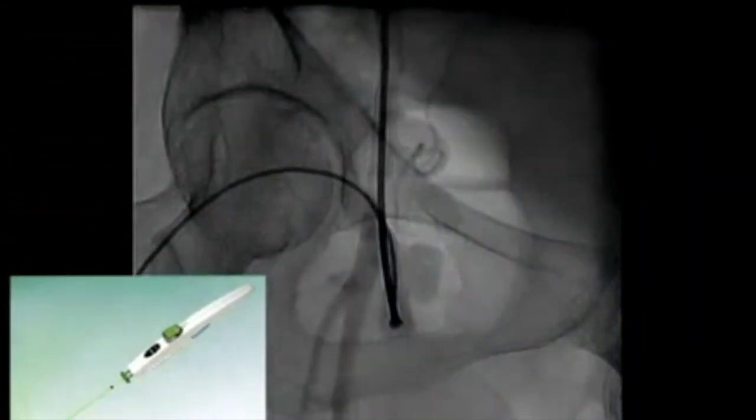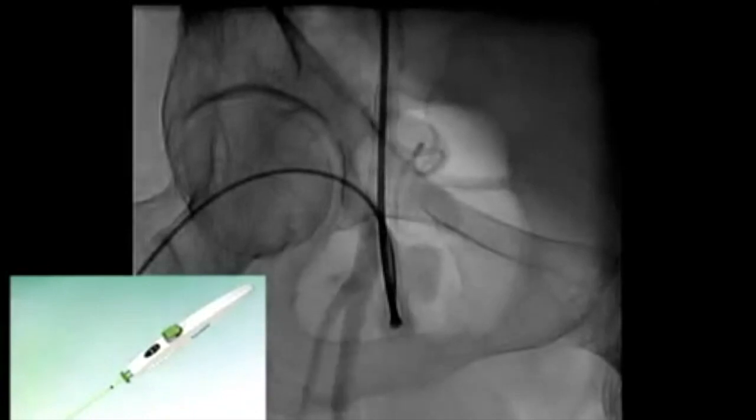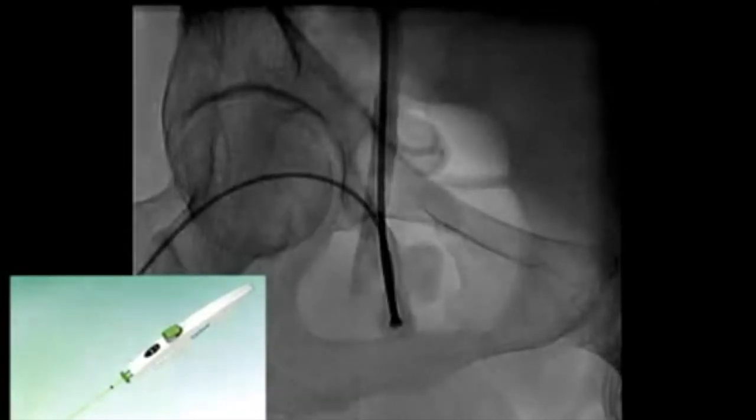After completion of the catheterization, verify that the femoral artery is suitable for arteriotomy closure with the ExoSeal device.